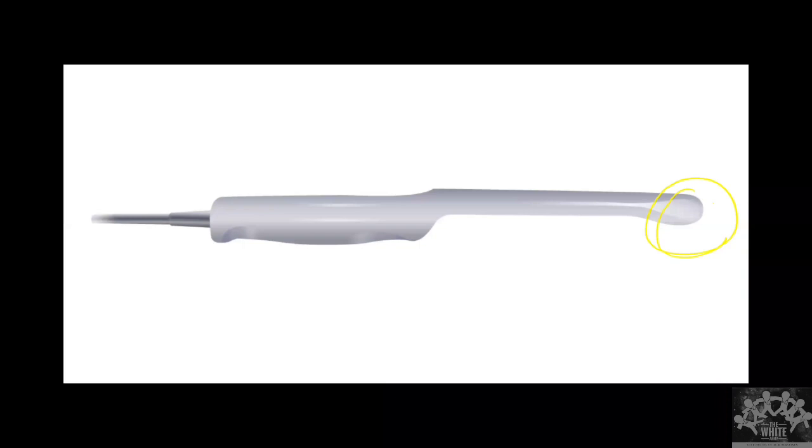Now, imagine you are doing a scan on a pediatric child. You are using a linear probe, but the linear probe is not penetrating enough. Then what do you do? You don't always have to use a curvilinear probe. Sometimes you can even try the transvaginal or transrectal probe to see the slightly deeper structures, which are not seen on the linear probe.